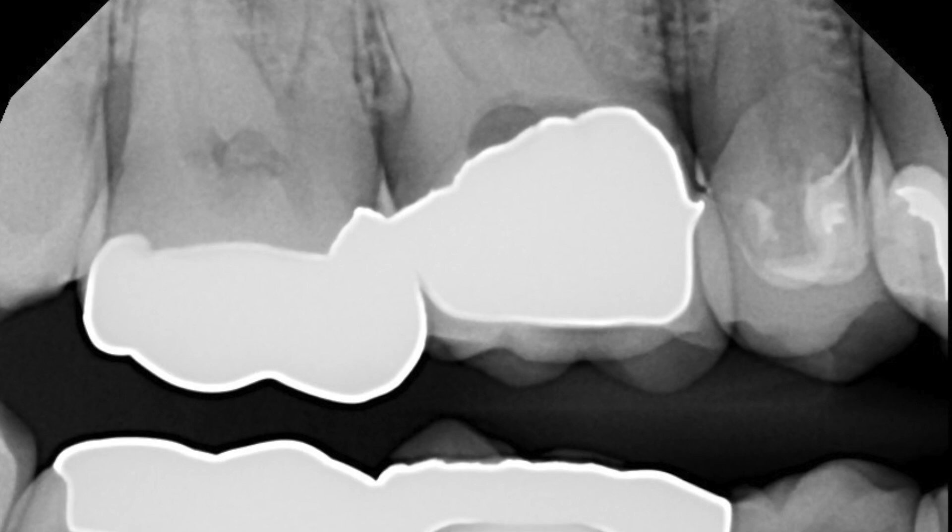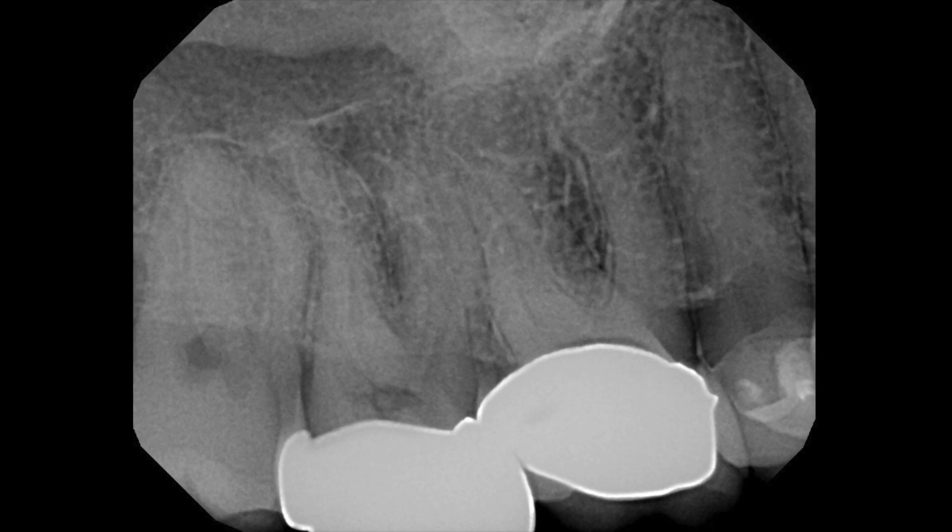This helps you see the extent and orientation of the previous access preparation and also helps in access reorientation to find the calcified canals. The bitewing shows us that the access is not impinging on the furcal floor, it may be slightly leaning towards the mesial, but it also shows us that the canals are present and appear to be close by. The mesial buccal root appears broad and an MB2 was suspected. A CBCT wasn't indicated as the standard radiographs appeared adequately diagnostic.